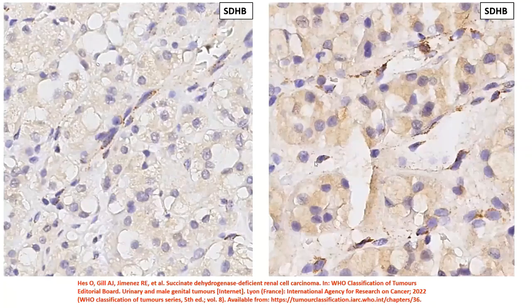Now, I was talking about the succinate dehydrogenase B expression. So you have a loss of succinate dehydrogenase B expression in these tumor cells. As you can see, the pattern of SDHB could vary from absolutely absent to a slight granular pattern, but even that would be treated as negative. What is the control? The control are your background endothelial cells, which will show a characteristic coarse granular positivity within the cytoplasm. So with this kind of expression in the background endothelial cells, when you compare the cells of the adjacent tumor, you will find that there is an absence of expression of the succinate dehydrogenase B protein.